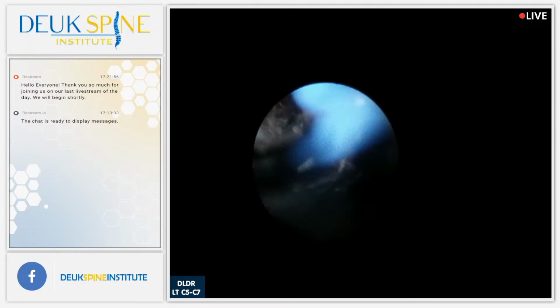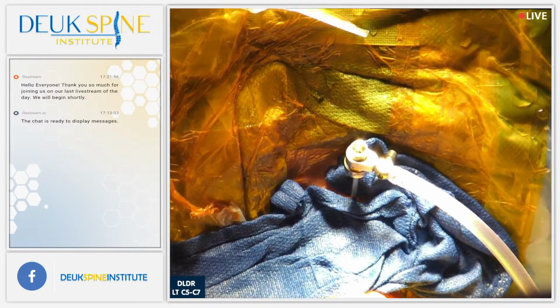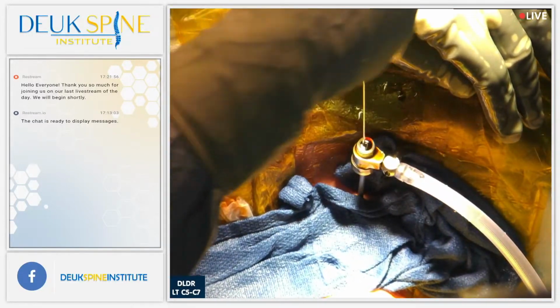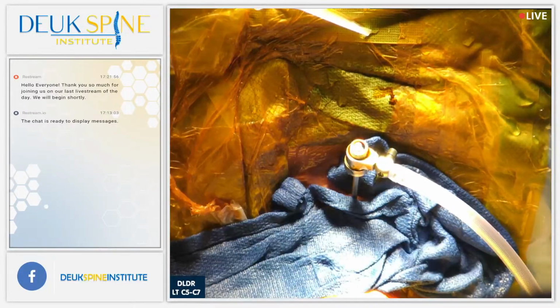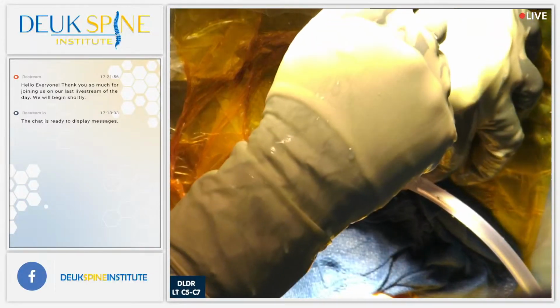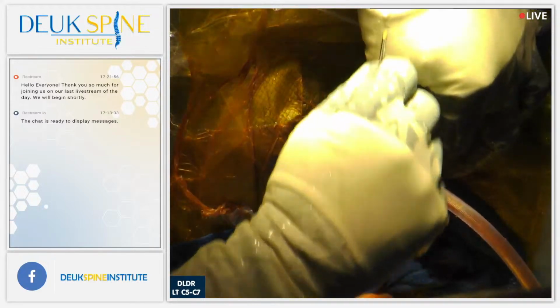All right. Scrub off, please. Lights on. Looks good. I'm happy with that. Irrigation. We'll use a little betadine developed at NASA to fight the possibility of space cooties.